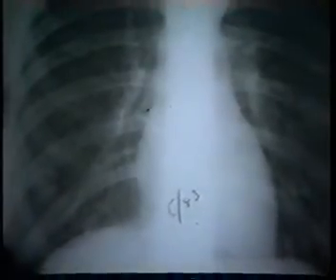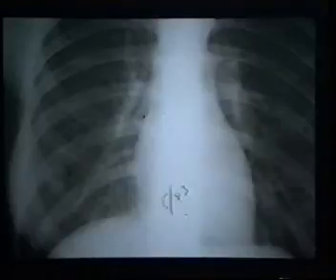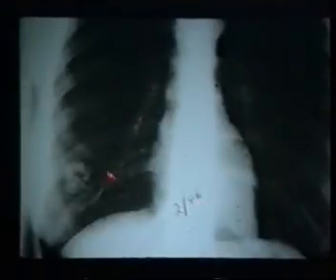With the time left to me, there's one other entity. I don't know that it would necessarily be considered a typical entity that is discussed in this subgrouping of patients, but I show it to you anyway because we have seen one and I've become interested now. There have been others reported in the literature. This is from 583. You can see that there is a mass in the right lower lobe. This is approximately 7 months later. You can see that this mass has grown, has a somewhat curvilinear configuration.